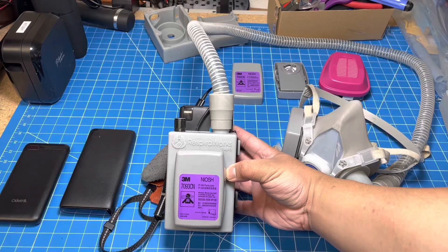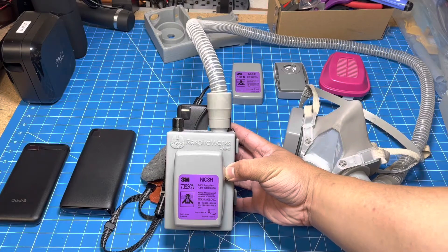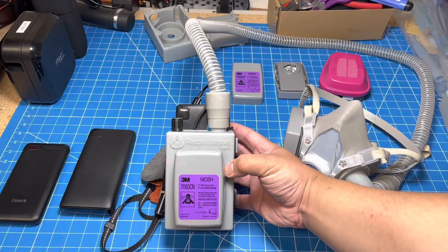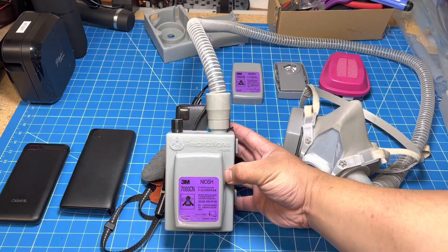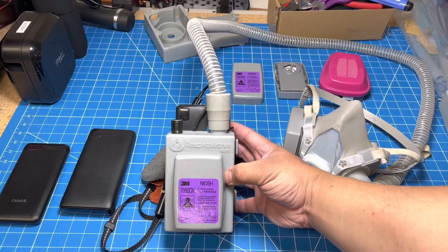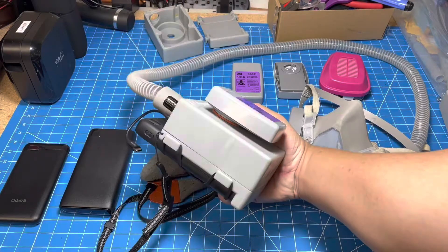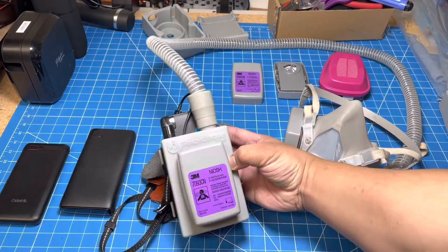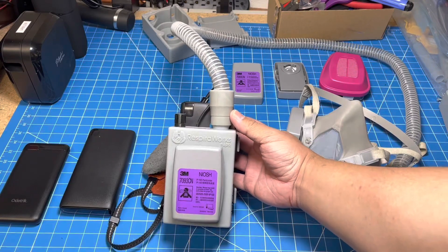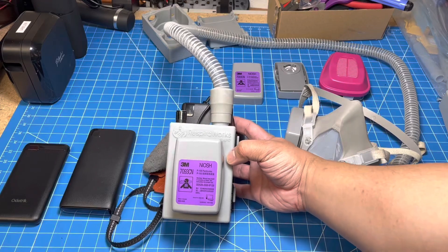Hello, everyone. Today I'd like to introduce another RespiraWorks project: the RespiraWorks PAPR. In addition to our ventilators, we've been designing these as a response to the shortages in PPE. So what this is, is a PAPR — stands for Powered Air Purifying Respirator. It's a wearable device that consists of a battery pack, a blower, and a filter, and it provides a constant stream of positive pressure filtered air to the user. So it's essentially a wearable, portable air purifier.